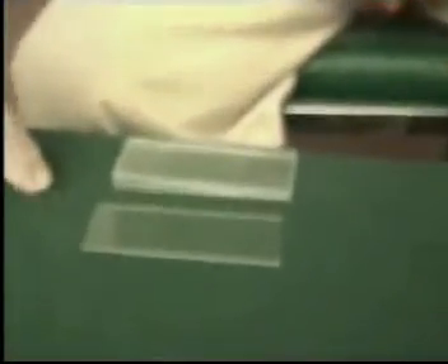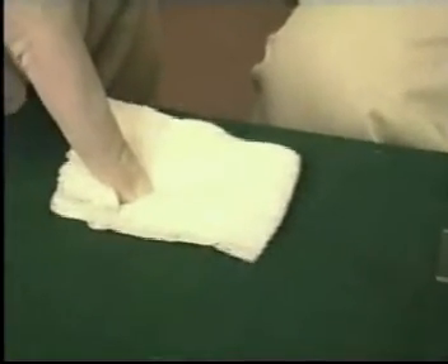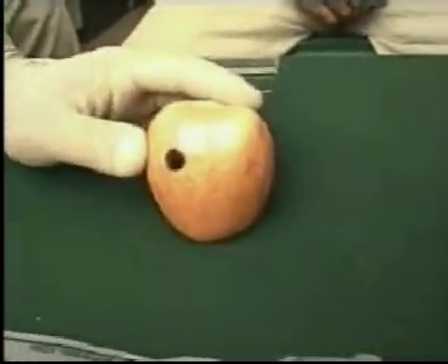To perform an FNAC of a lesion, we will need a 10 cc disposable syringe, glass slides, and a gauze piece or spirit swab.